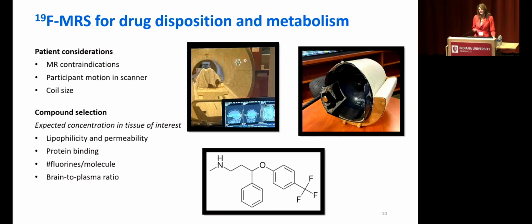Participant motion and scanner is another consideration. So with any MRI, you really have to hold still. If you've ever had one, you might remember being told, don't move your knee or don't move your head, right? If you're moving a lot, that's going to interfere with the data acquired and potentially alter what you're able to do with that downstream. So we do have to have our patients stay very still. This is possible in pediatrics. We do this, and most of our patients tolerate it very well. For these images, we often have them watch a movie or listen to music while they're getting their scan done.